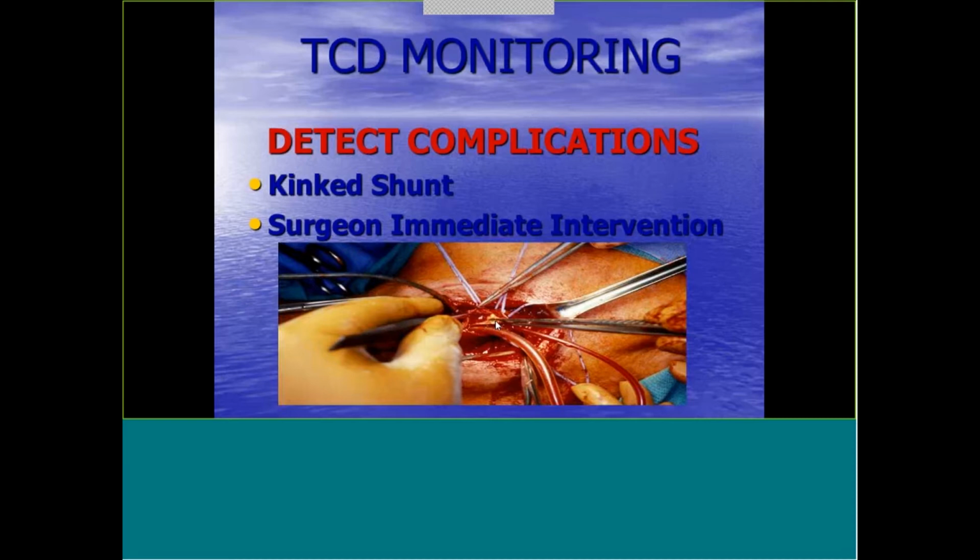So it's good to have a one-on-one with your surgeon, and trust me, usually surgeons that monitor with TCD, they want you there for a reason. Your reason is to keep monitoring the brain while they're working on the neck. So surgeons are very, very receptive to our input. So don't be intimidated by them. And anesthesia, again, will become your very, very good friend.